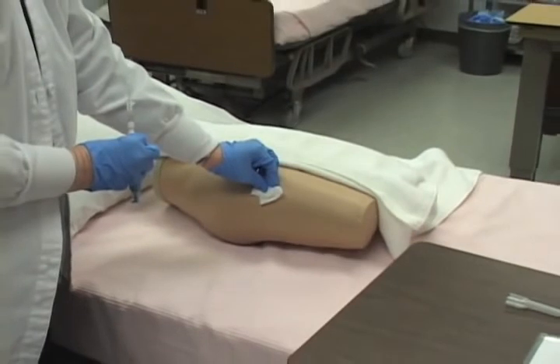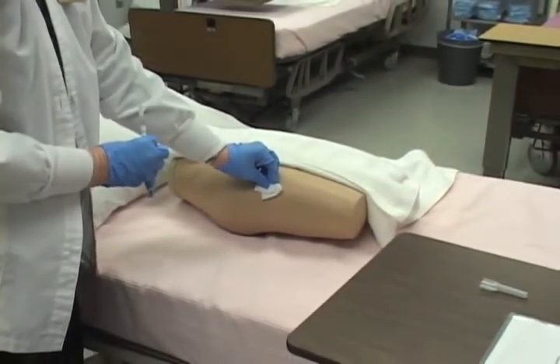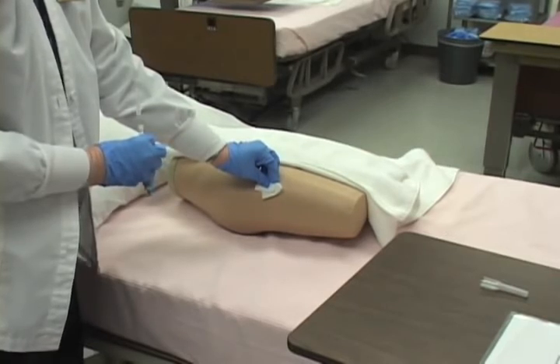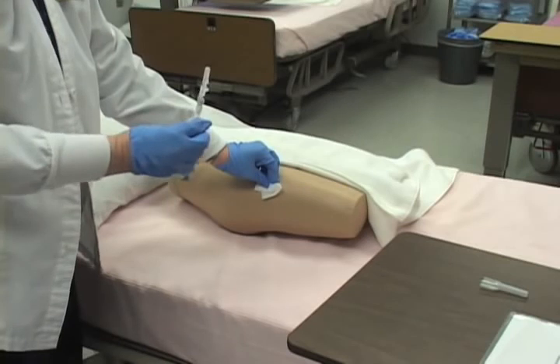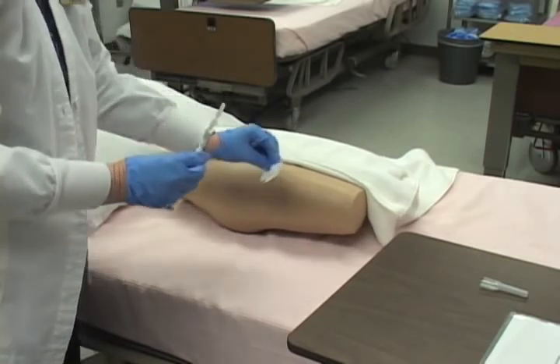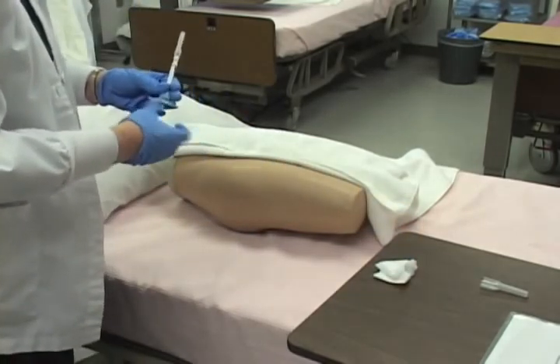This seals the medication within the muscle layer it is intended to be delivered to and does not allow the medication to track backward into the subcutaneous tissue, causing irritation and changing the absorption rate. Apply gentle pressure to the injection site. Do not recap your used needle. Activate your safety shield. Discard the needle and the syringe in a sharps container. Assist your patient to a position of comfort.